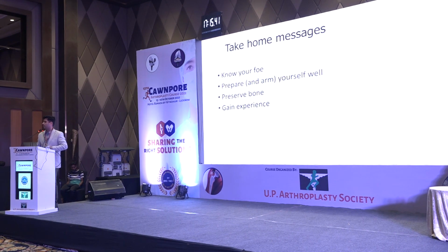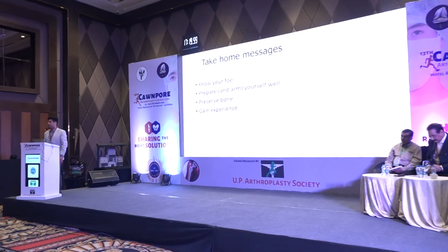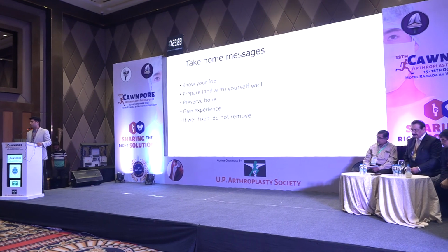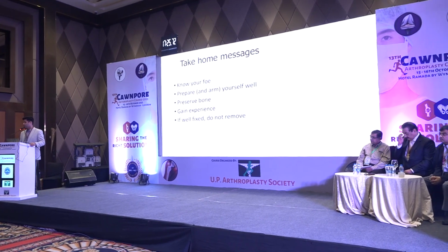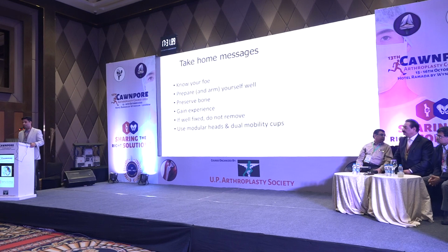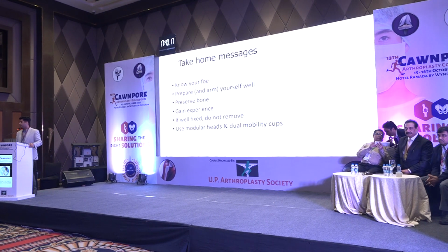Don't try to go back after this course and start doing revision of cemented or uncemented bipolars from tomorrow itself. If they're well fixed, as Dr. Prasad just asked me, do not remove them. Please don't remove them. You must be hard pressed because of some stupid reason like not getting a dislocation to remove them. But if you're ready, then you will, of course, think of it beforehand and use modular heads and dual mobility cups wherever in doubt.